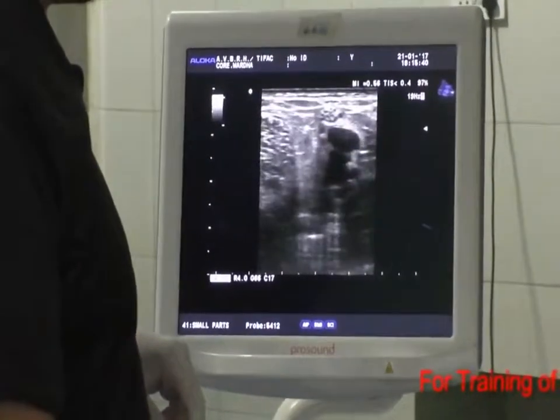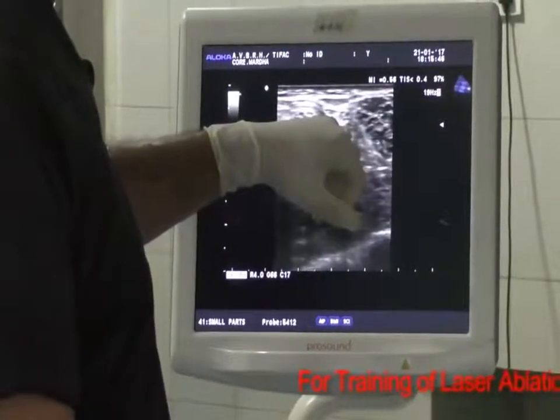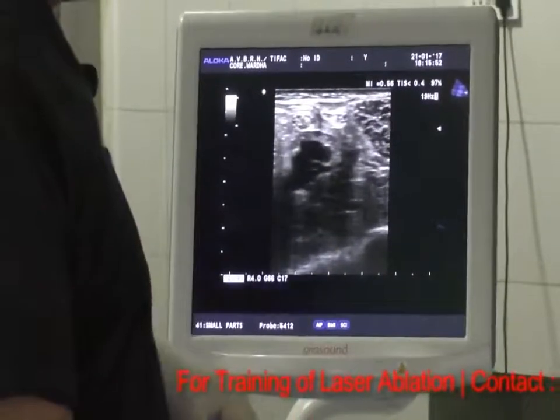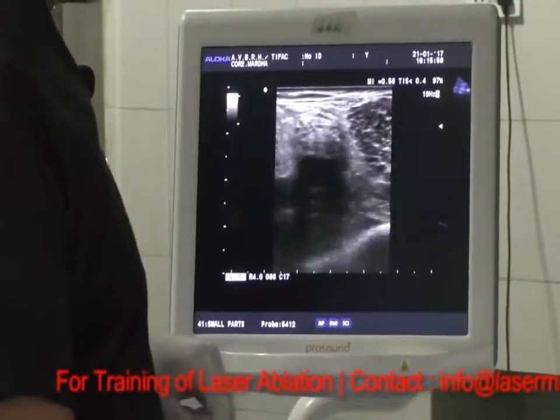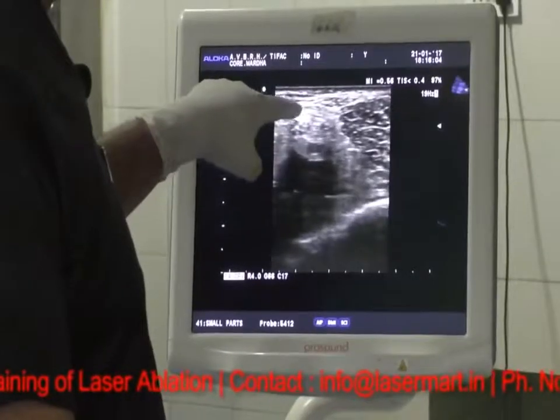If we traverse this tibial nerve and press it in the cephalic direction, what we can observe is there is another root coming and just getting merged into this tibial nerve. This is known as the common fibular nerve, and these two nerves come together and form the sciatic nerve.